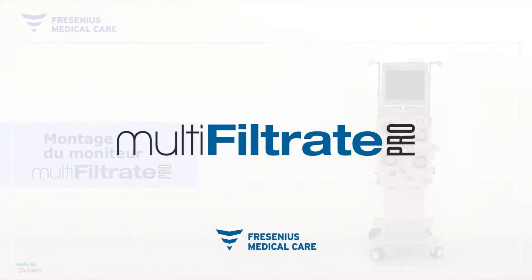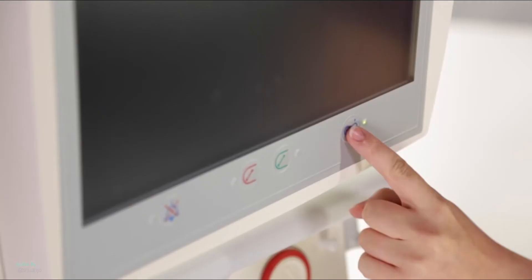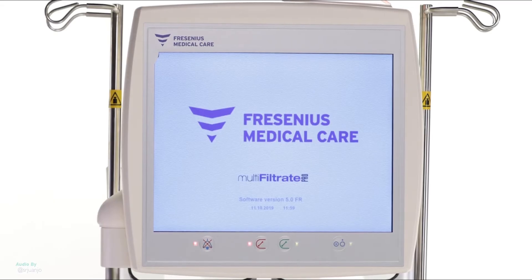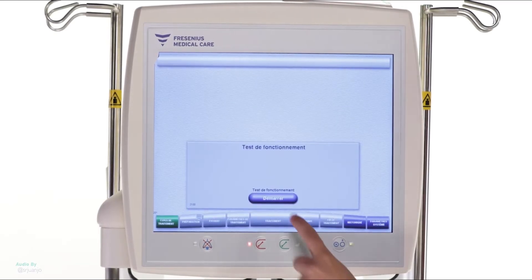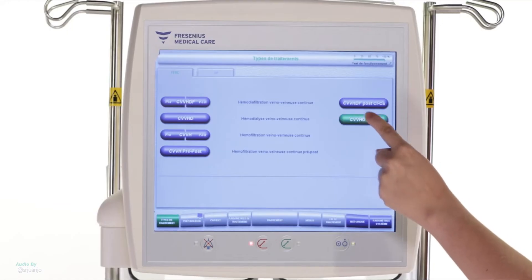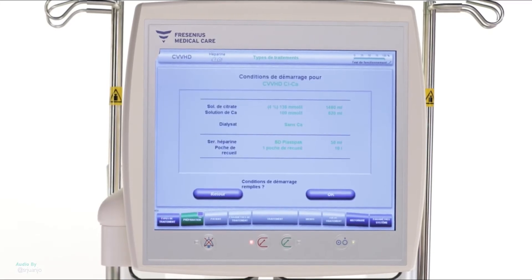Mounting the Multi-Filtrate Pro. To turn on the device, press the button for a few seconds. Then press Start to launch the operation test. While doing the test, select the CVVHD Ci-Ca Treatment Mode. Check what is needed before starting, and then press OK.